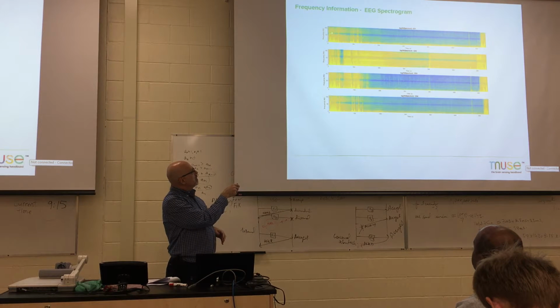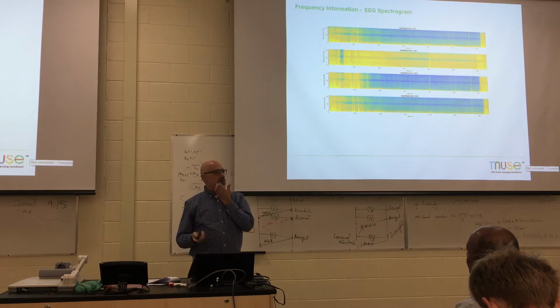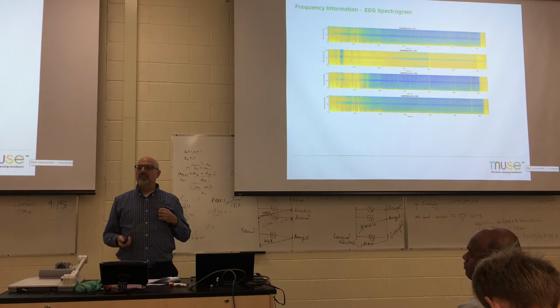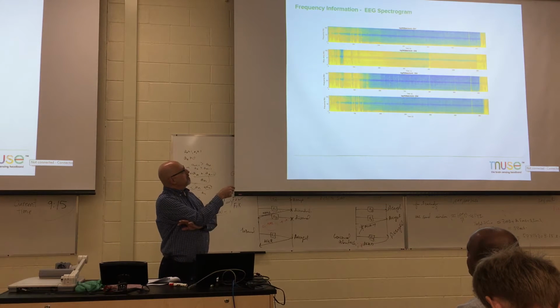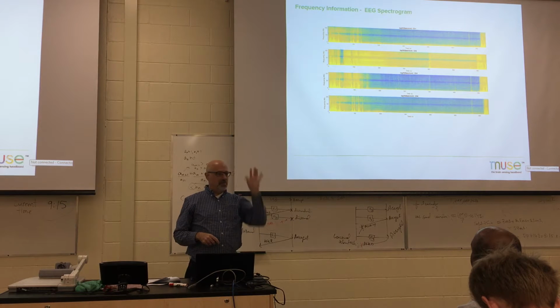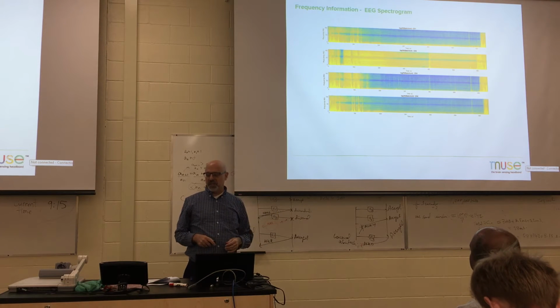And here at 60 hertz, there's a blue line all the way across for most of the signals. Any ideas of what that could be in terms of that pattern? Just like an oscillator with all the 60 hertz noise? Yeah, that's exactly it. And then here in channel 2, it looks like there's a lot of energy all the way across. I would say that electrode just never got connected to the skin, and it's oscillating wildly from one rail to another. There's a lot of power in that signal, but it's not brain signal.